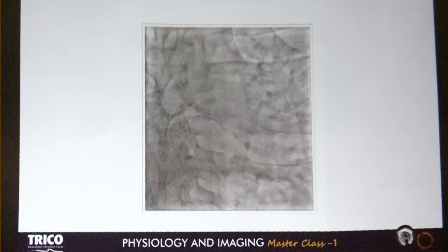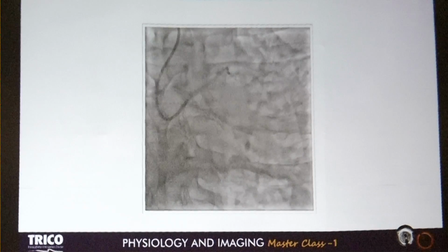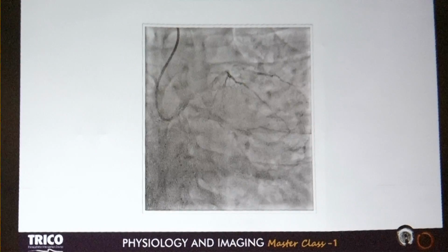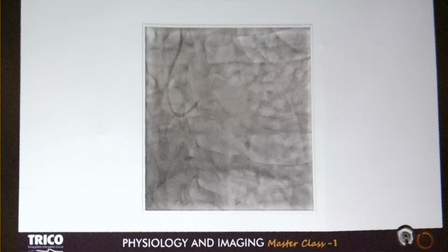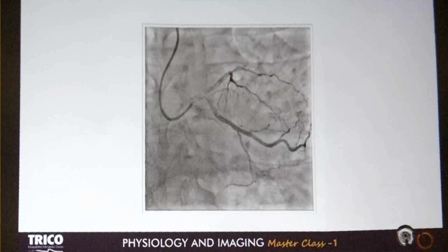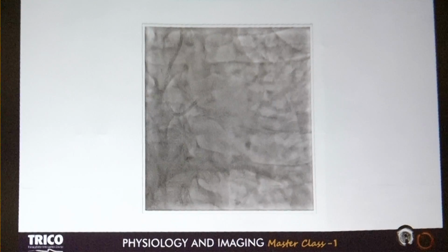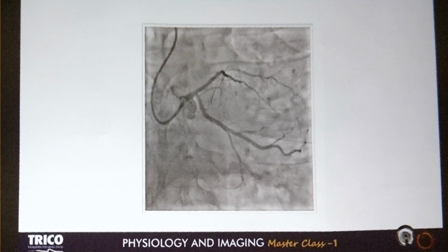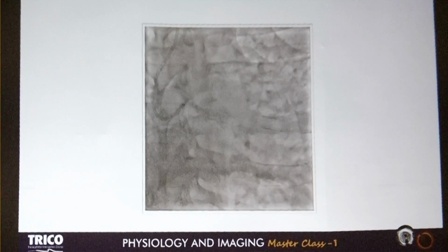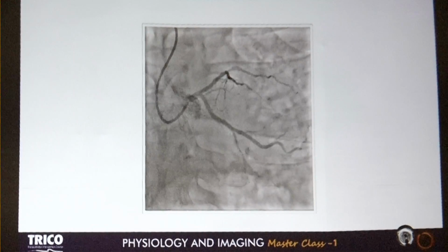Anybody have any objection for this left main ostial stent result? It looks fine to me. Distal edge was fine. There was no problem. At the ostium, just tell me. Now, epicardial was also good.